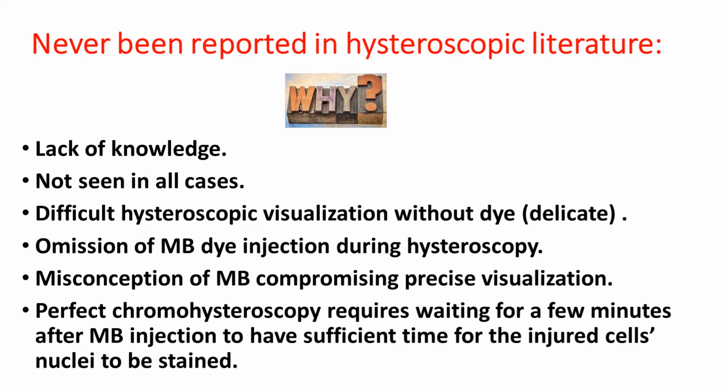This is true because, number one, lack of knowledge. Number two, it is not seen in all cases. Number three, it is difficult to see unless you use chromohysteroscopy because it is a delicate line.